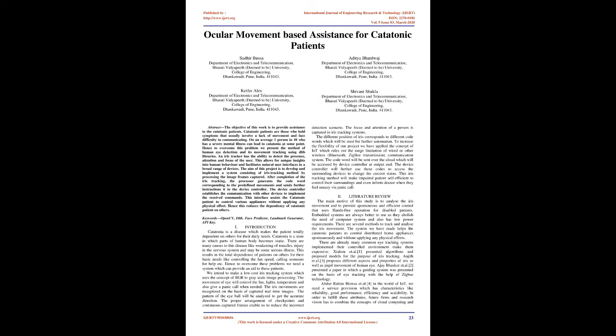Hence, to overcome these problems, we need a system which can provide an aid to these patients. We intend to make a low-cost iris tracking system which uses the concept of BGR to grayscale image processing. The movement of the eye will control the fan, lights, temperature, and also give a panic call when needed. The iris movements are recognized on the basis of captured real-time images.